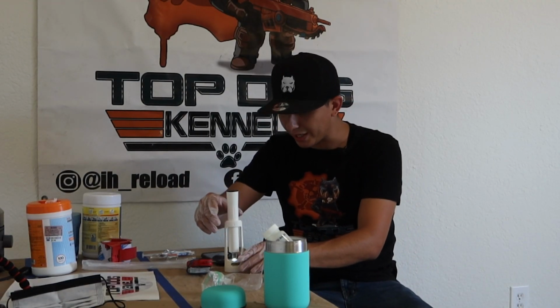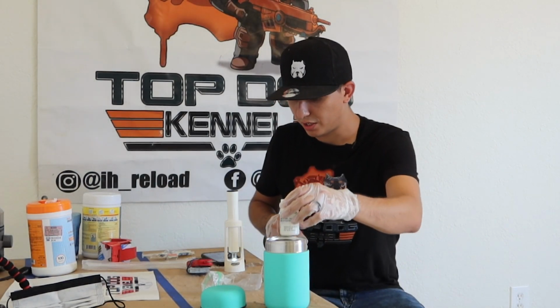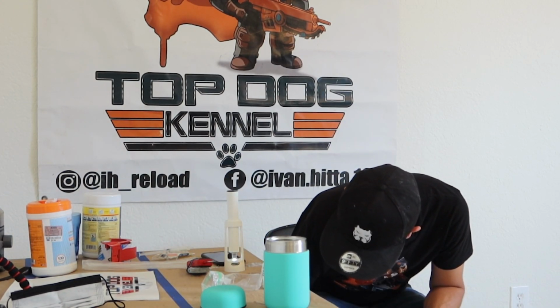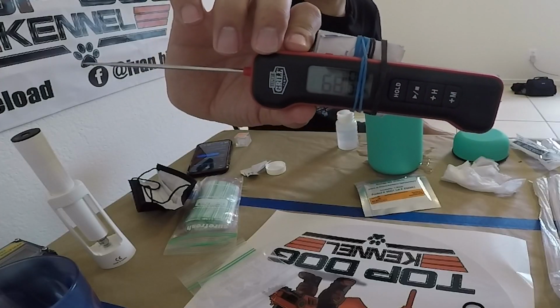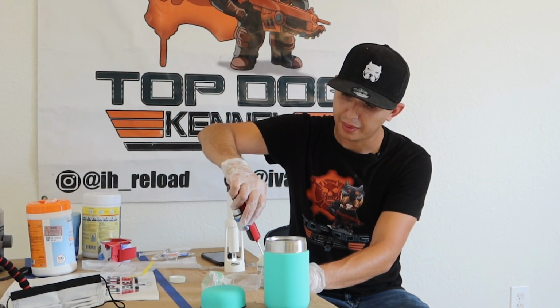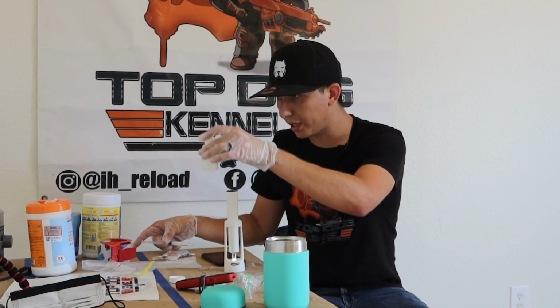Now what you want to do next is we're going to mix the extender with our sample. You want to do this into a sterile bag. So you want to make sure you have one of these handy. And the next thing you want to make sure is you want to take the temperature of your extender and make sure that it is at 100 degrees before you combine the two. Or at 100 to 99, and we're right at 99. So we're good to go ahead and mix the semen into the extender.